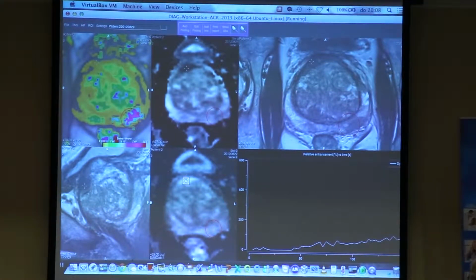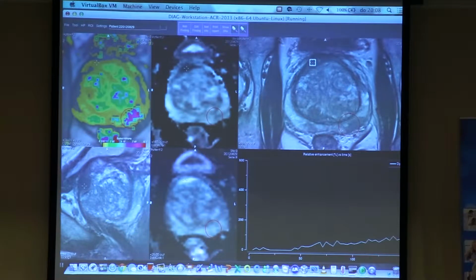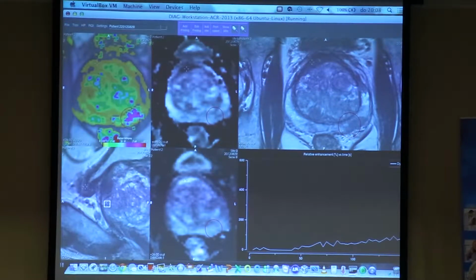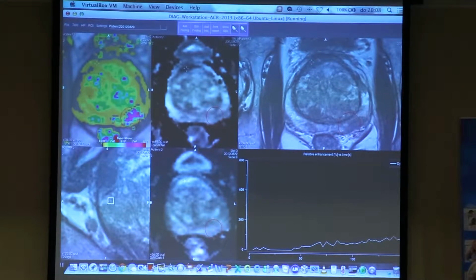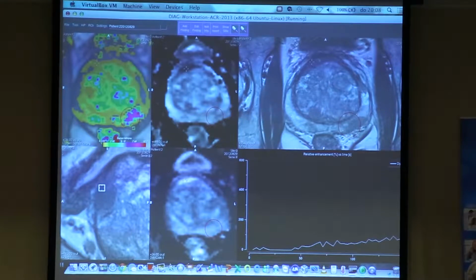It's bright, isn't it? And what about a T2? There you go. Yeah, lenticular shape. It's bulging a little bit outwards. I can move a little bit up and down. And now I would like to show you here and zoom it in. It's a nice thing about this tool. You can see here an area. This is the tumor, bulging out a little bit. It is just below the bladder wall.